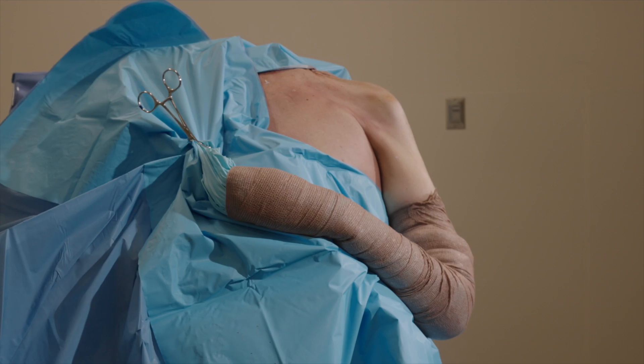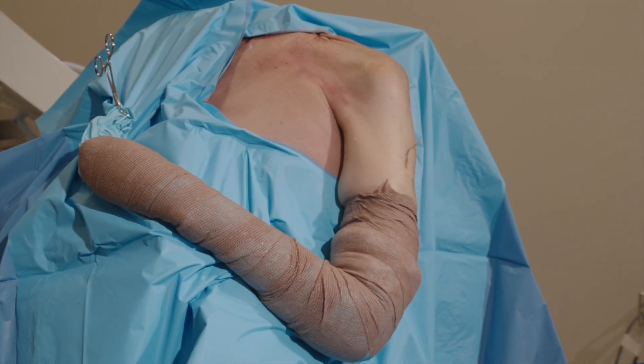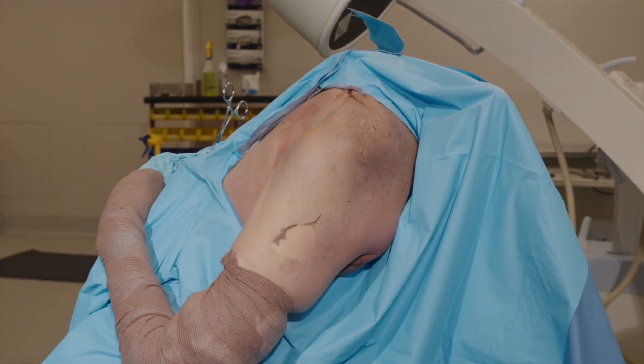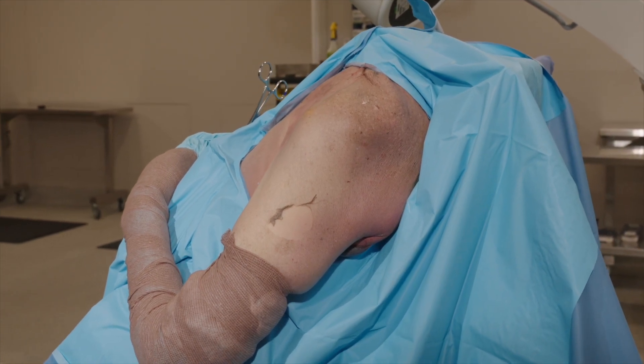The patient is positioned so that proper exposure and access to the posterior lateral clavicle can be obtained. For example, the patient can be positioned in beach chair on Allen or shoulder table. Alternatively, the patient can be positioned on a regular or radiolucent table with a bump between the shoulder blades.